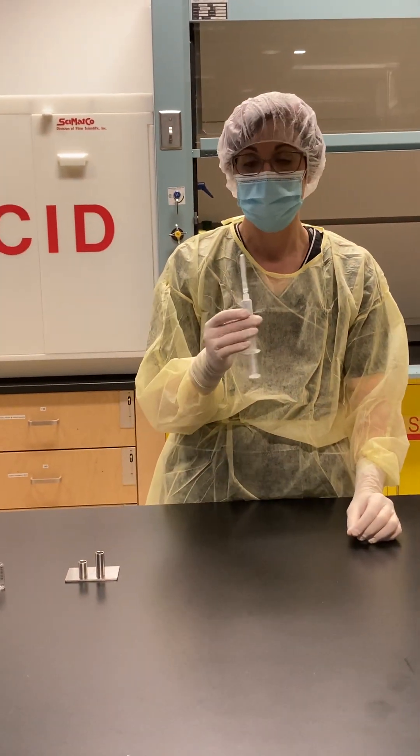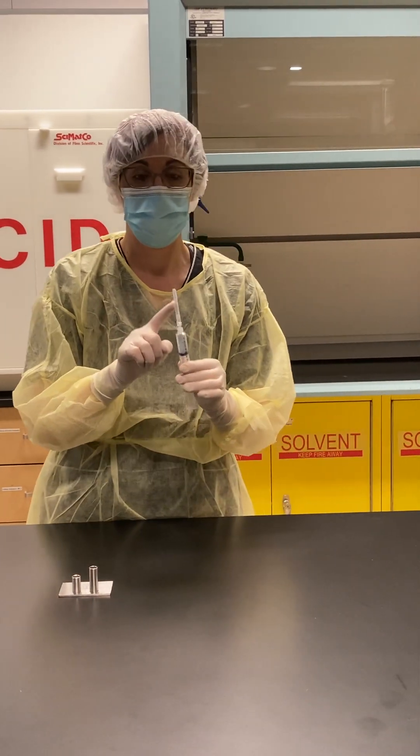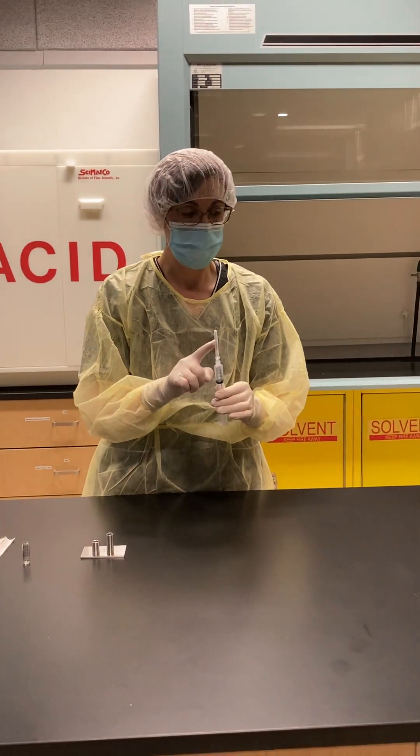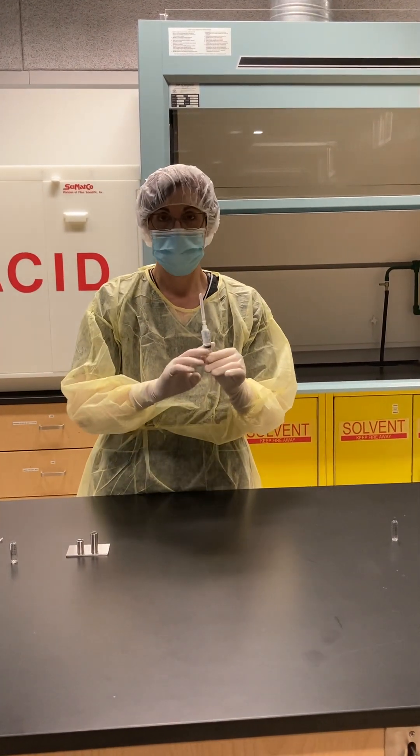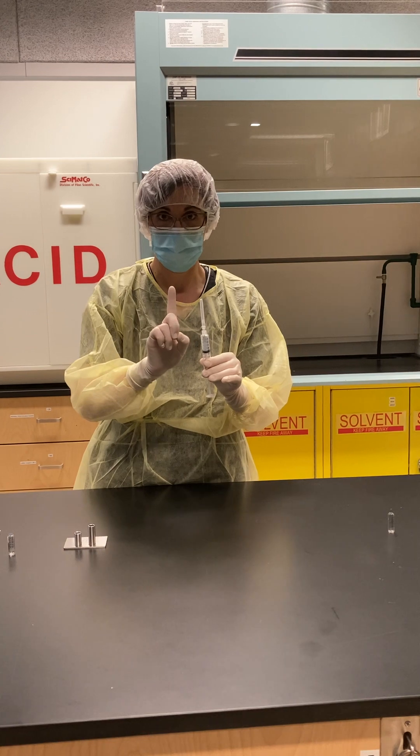It's also important to remember that when using filter needles, they are one way. This means that if I've used it to draw up from my ampoule, I can't use it to push air or fluid out of it.